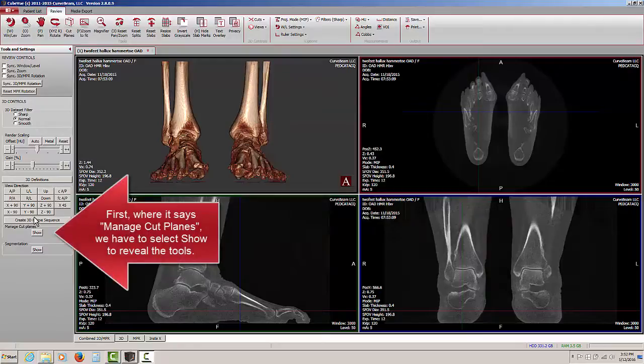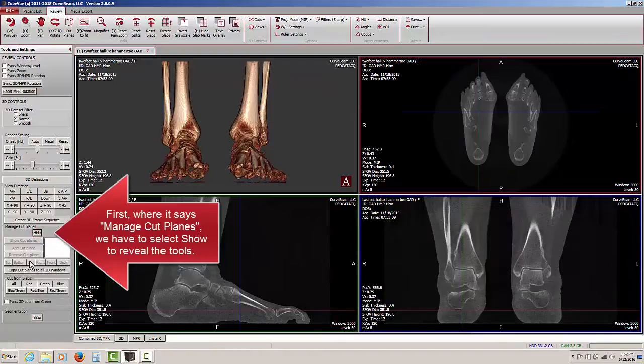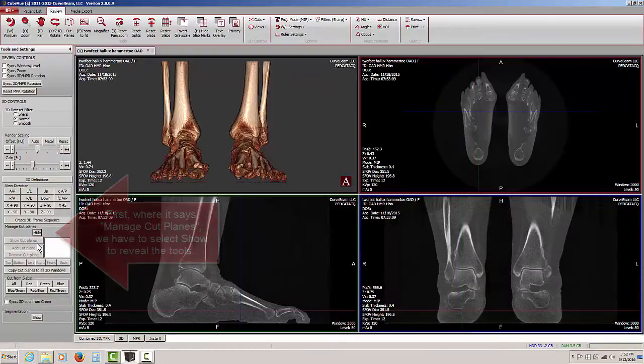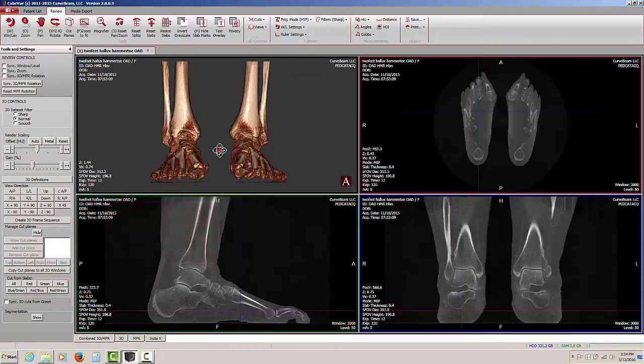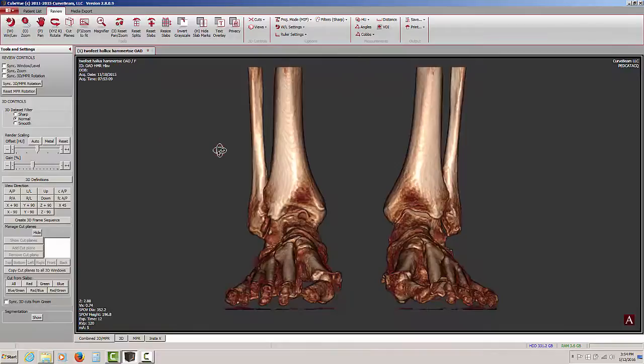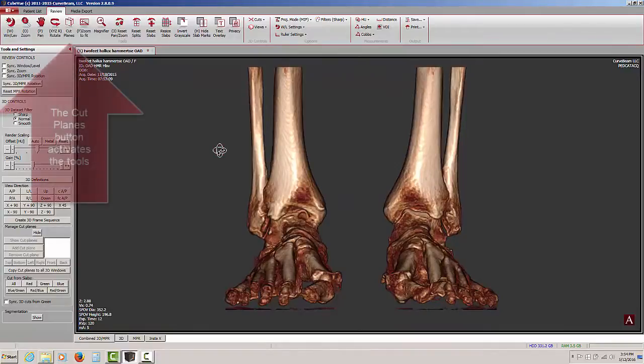On the left hand pane, down towards the bottom, it says manage cut planes. Clicking on the show button, we then see the cut plane tools that are available to us. I'm just going to double click and bring this image full screen.